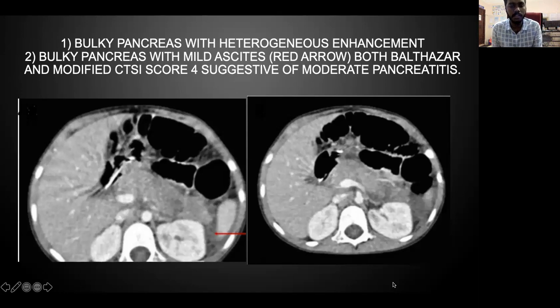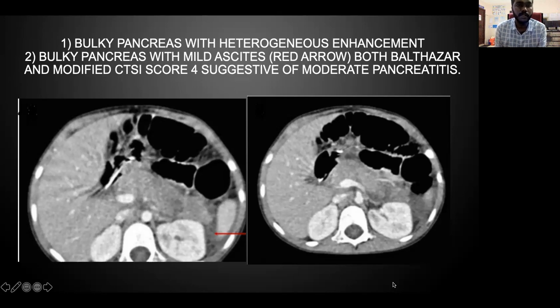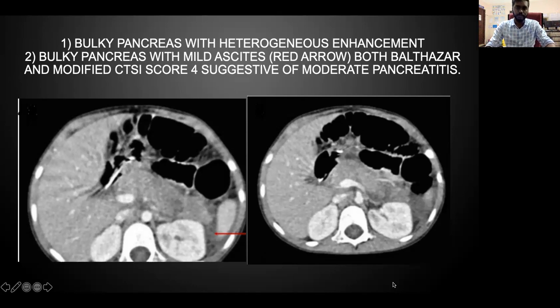These are the images taken during the study. The first image shows a bulky pancreas with heterogeneous enhancement and mild ascites. The modified CT severity index and Balthazar scores are both 4, suggestive of moderate pancreatitis.